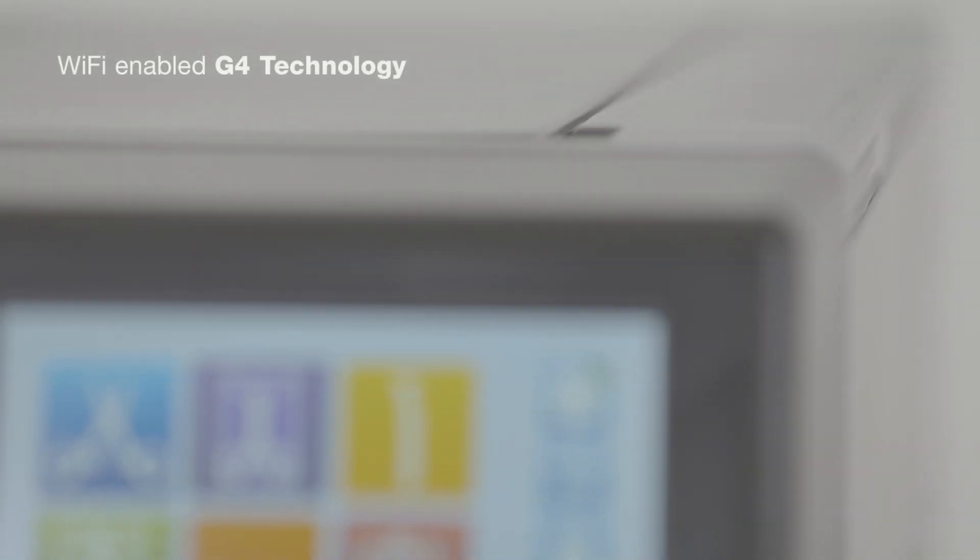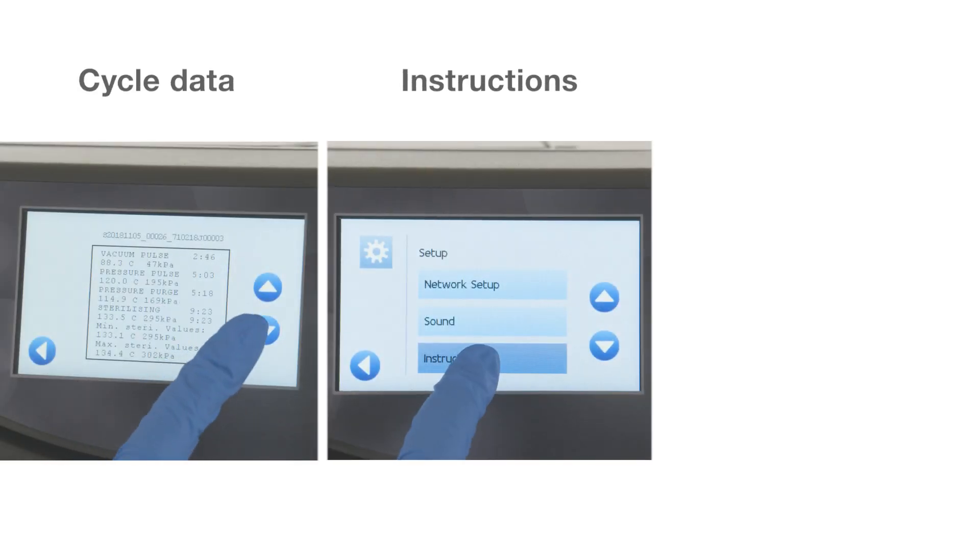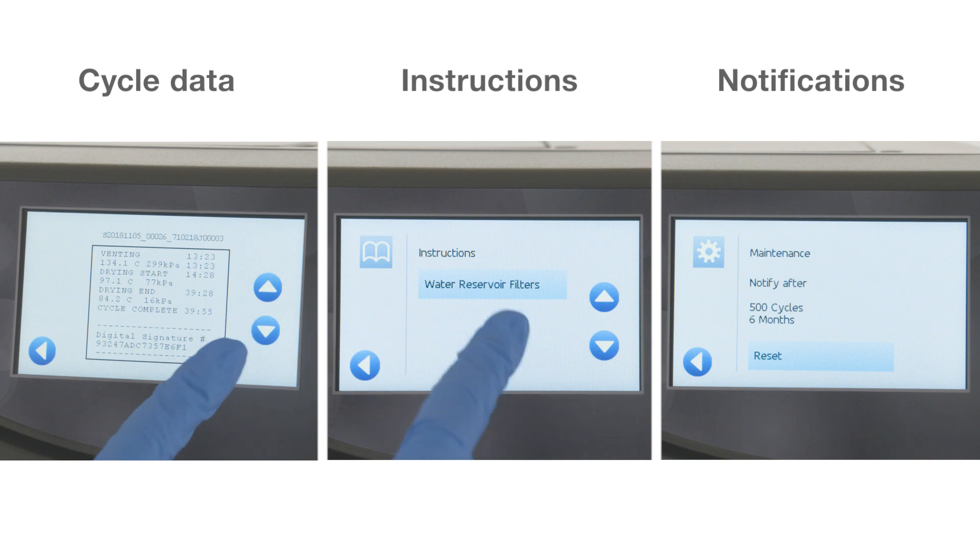Wi-Fi enabled G4 technology can connect and send information so you can have cycle data, instructions and maintenance notifications at your fingertips.